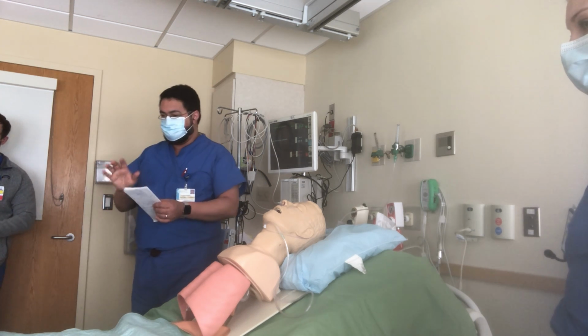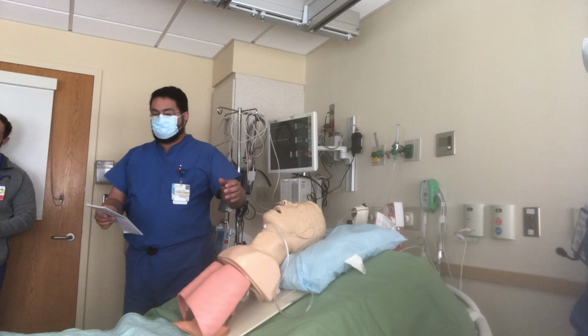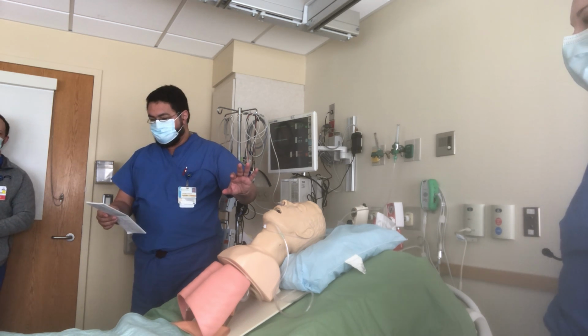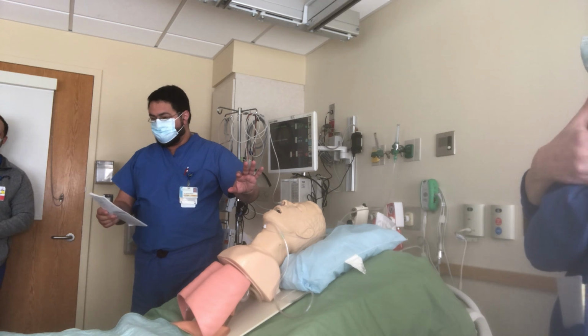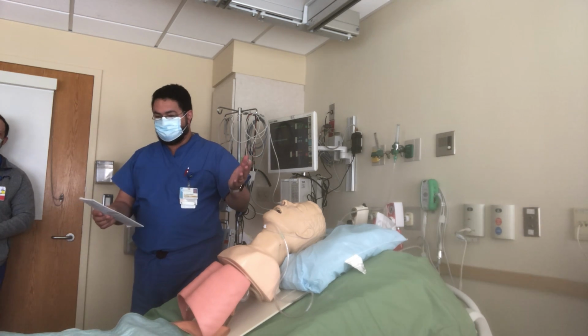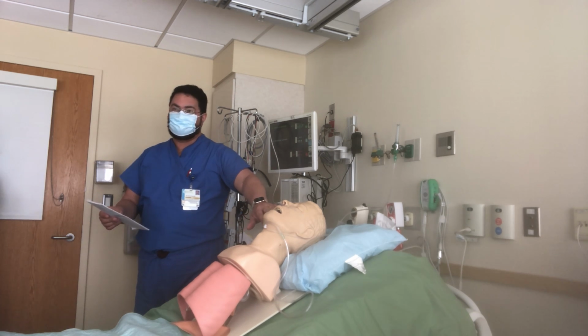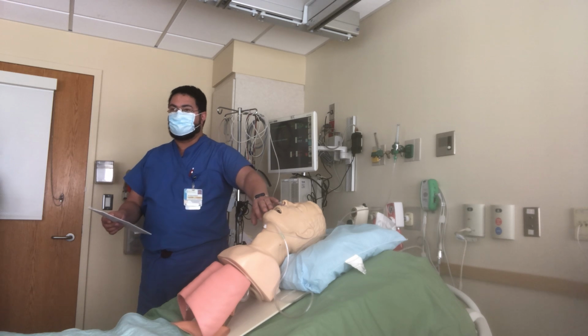So now we got the airway box. Do you want to do MAC light or glide scope? So now we're going to do the MAC blade. Before you do the MAC blade, it's 90%, right? So you need to assess the airway. Let's say you assess the airway and it's a difficult airway.